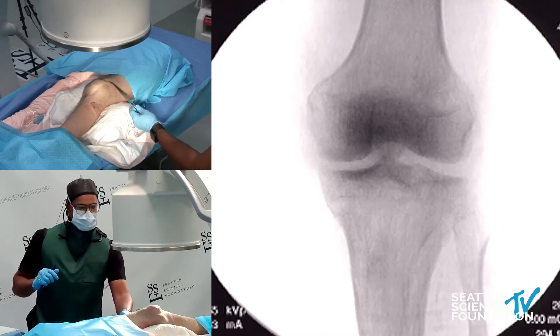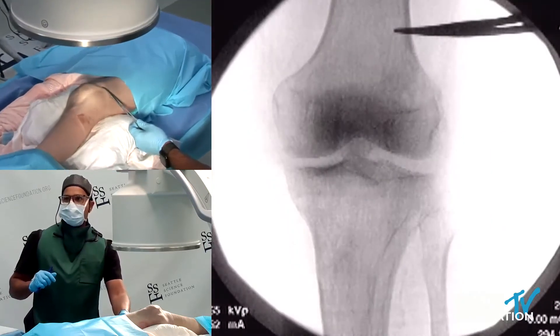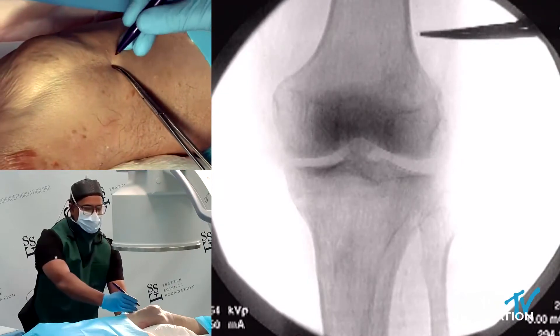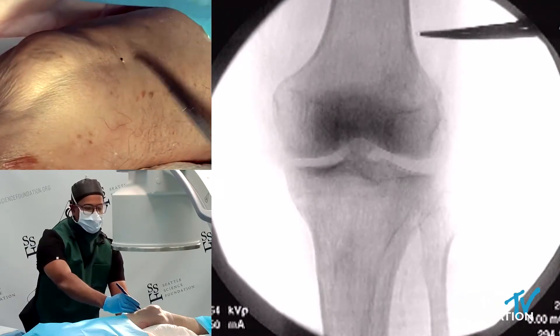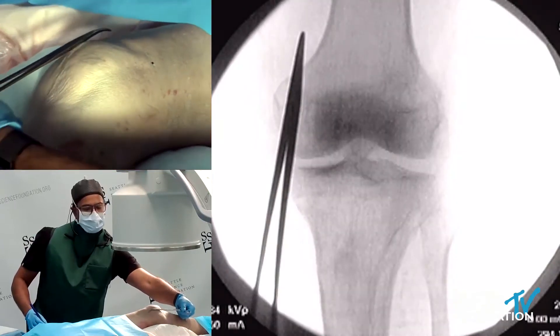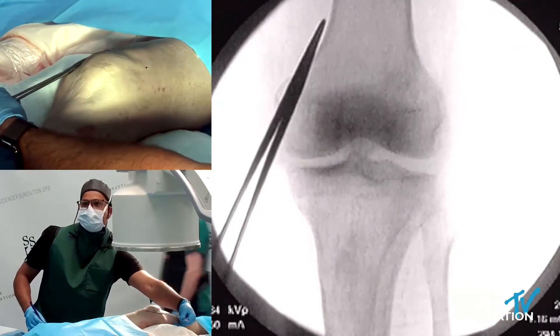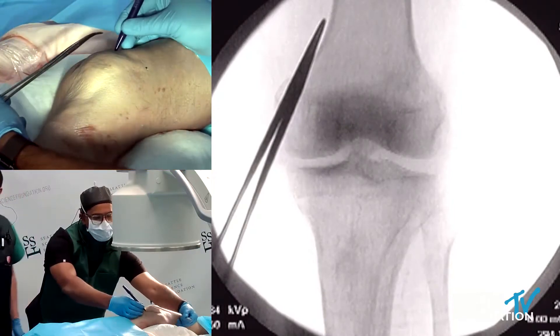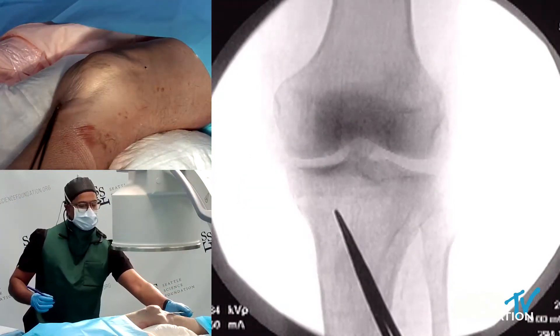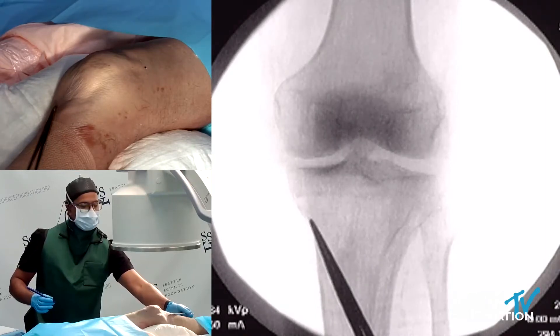To get started here, I will start to radiographically mark out my target points. It's okay to be a little bit off the os here. There's my first, there's my second, and my inframedial — I'll go a little bit further out.